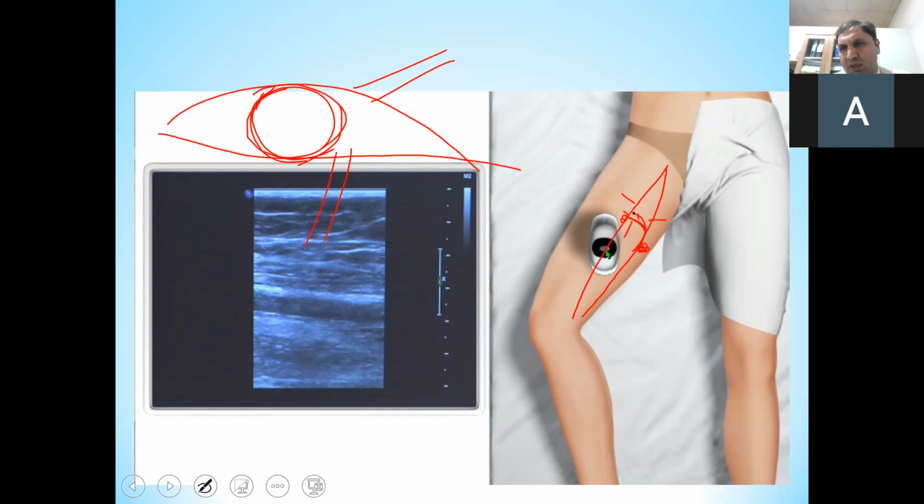If the blood is flowing in the perforating system from deep to superficial, then you can say that this is not the normal direction of blood flow. There are a number of groups of perforators, and you can have multiple side branches of the great saphenous vein as well, and these perforators can also be found between the side branches of the great saphenous vein and the deep venous system.